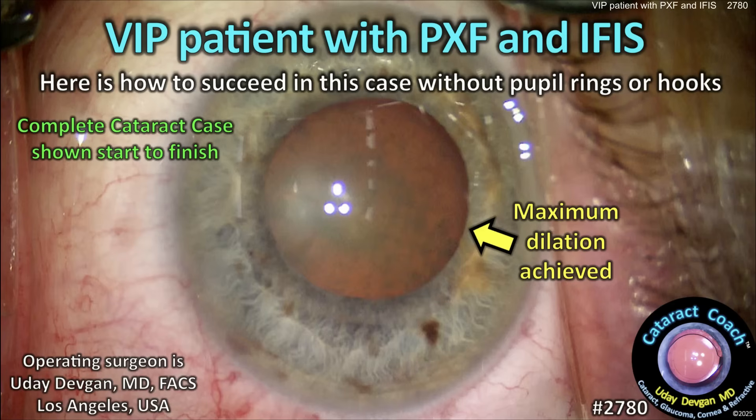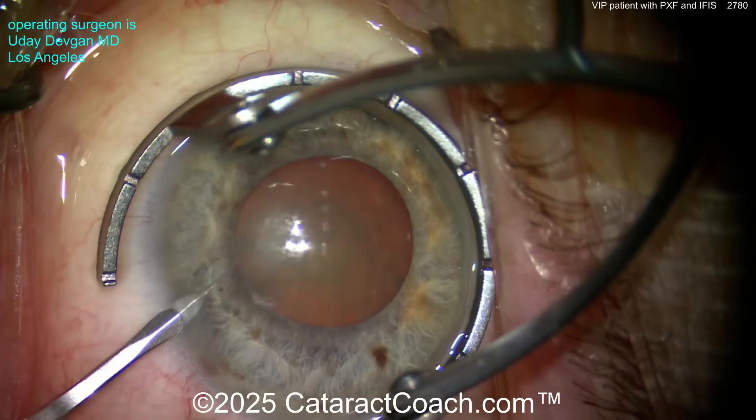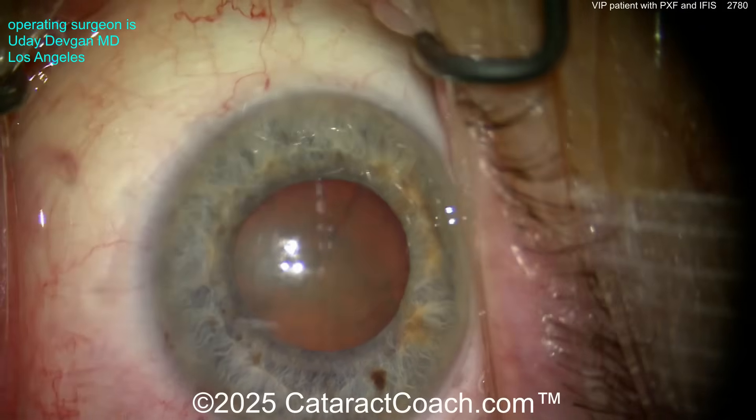Welcome to cataractcoach.com. I have a VIP patient with pseudoexfoliation and IFIS — intraoperative floppy iris syndrome. Here's how to succeed in this case without pupil rings or hooks. I can't tell you too much more about this patient, but trust me, this is an absolute VIP patient.